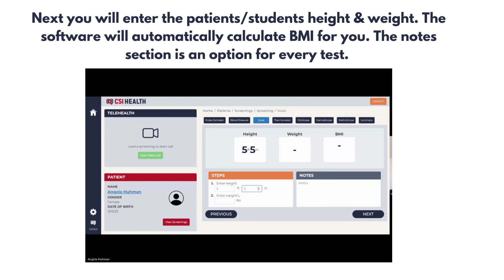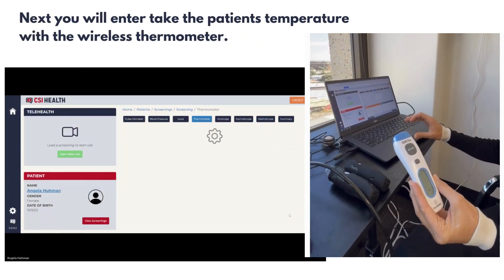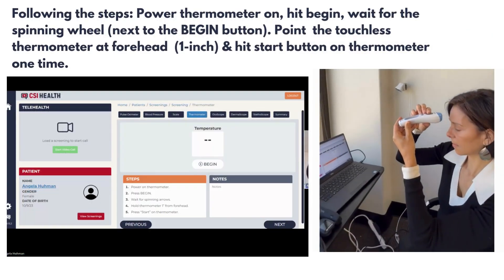Next, you will enter the student or patient's height and weight. Next, you are able to enter the patient's temperature with the wireless thermometer.